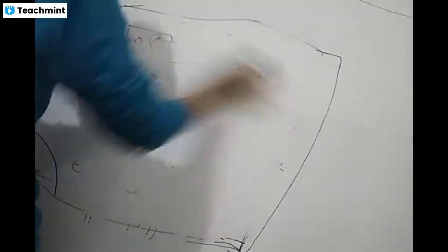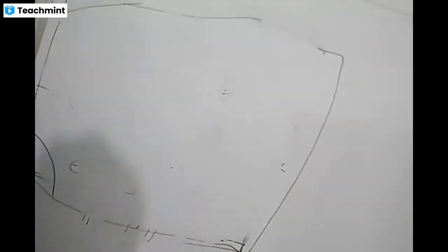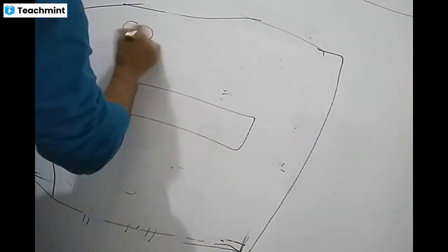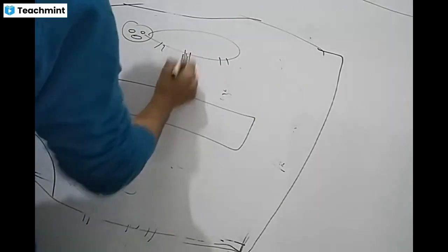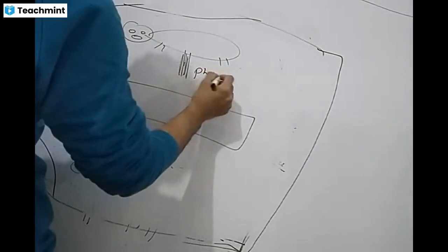If the crystal has this structure, then this is the film with emulsion, and this is the patient from which the X-ray beam is coming out. These are the X-ray photons.